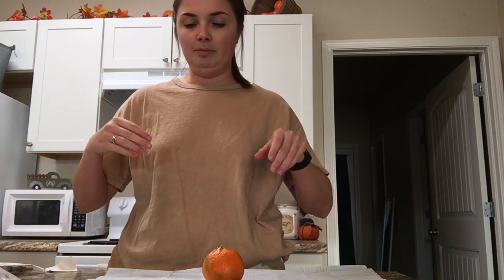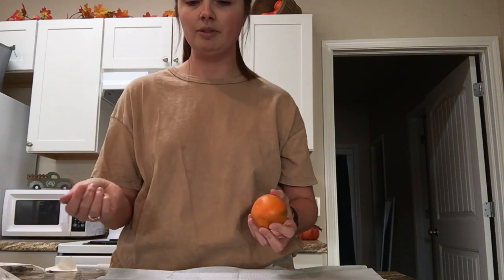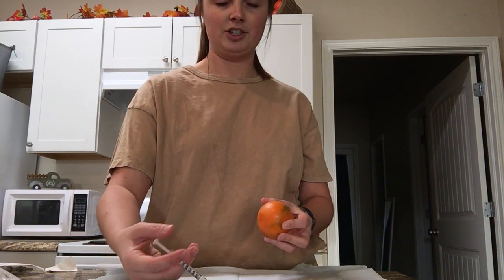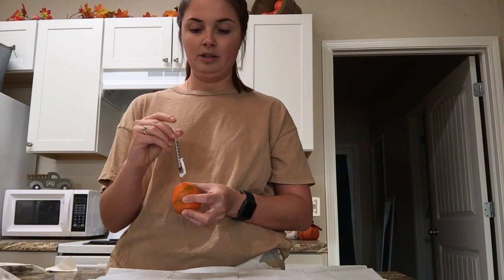So with SUBQ injections, we mostly do the abdomen or the fatty part of the arm. So here I'm just going to say that I'm going to do it on my patient's abdomen. So I'm going to pinch the skin of the patient that I'm doing the medication administration on. And then I'm going to go in at a 90-degree angle, just like I did with my IM injection. And then I'm going to dart the med in, push the 3 units of insulin, pull it out.